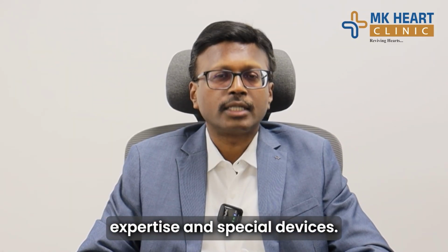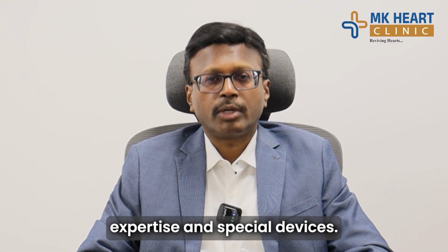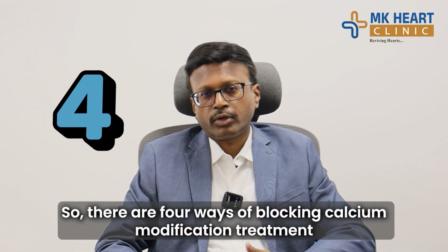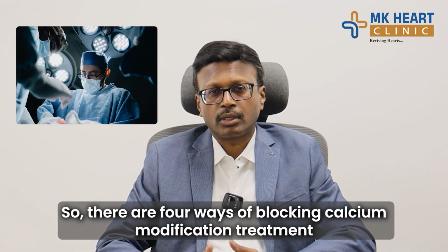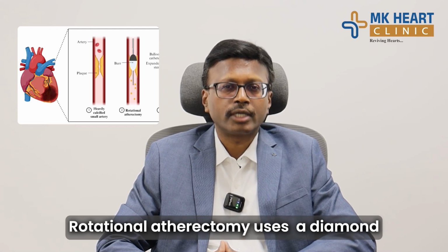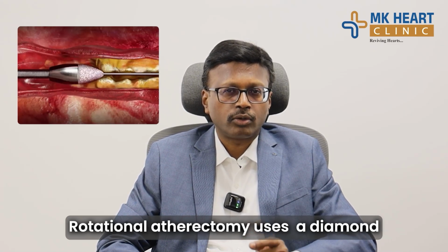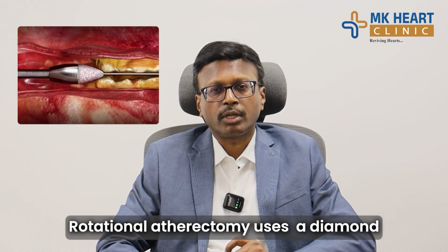For example, in calcified lesion, to break the calcium, we will be using devices called atherectomy devices. So there are 4 ways of calcium modification treatment. Traditionally, we used to break the calcium using a device called rotational atherectomy, which is a diamond coated burr, 1.25 millimeters to 1.75 millimeters in size.